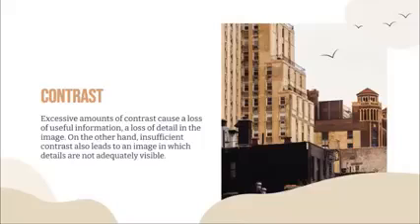So again, excessive amounts of contrast, high contrast, short scale. Pag super short scale, we call it saturated image. Katong pareha sa itong image na kung gipakita ganina. And then, loss of detail will occur. And of course, pag too much of a low contrast, daghan na kayo og shades of gray, dili na kayo maklaro sa atong limited capacity sa eye, therefore loss of detail also happens. Okay?